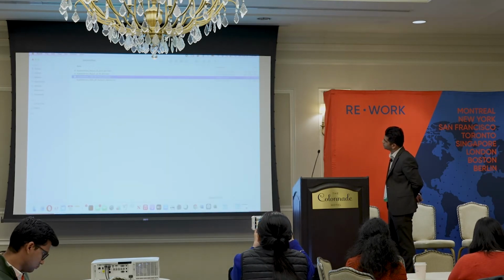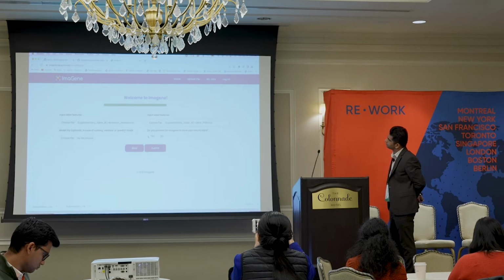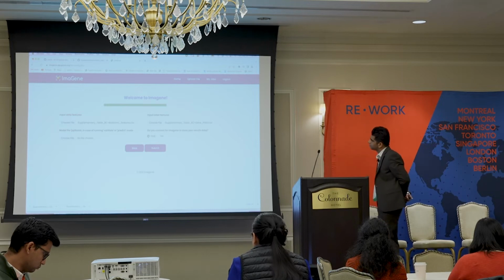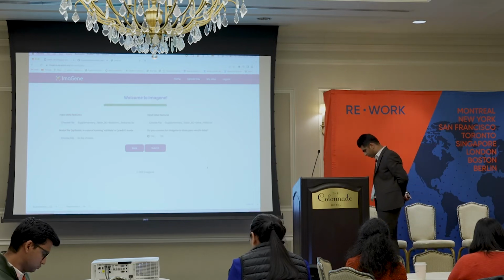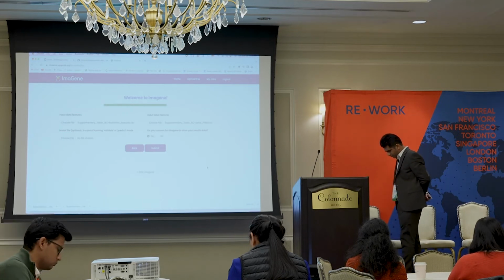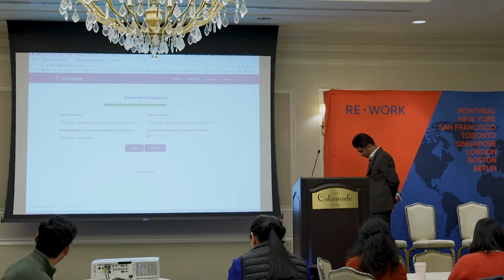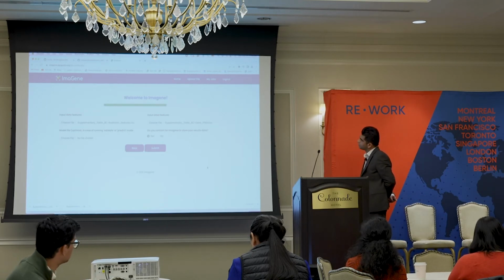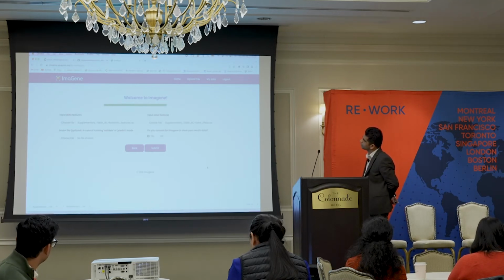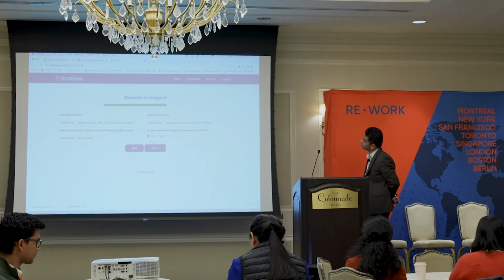Taking it further from there, once we have loaded the files, you have an option to choose whether you want to store the data for ImaGene, which is highly recommended, as this tool is meant to democratize radio-omic or imaging-omic correlations and machine learning models across the globe, such that a consensus could be arrived at on these models and radiogenomic reports thereof, to be shared across multiple labs worldwide. So I would highly request you to select yes. If you still think you don't want to share the data, feel free to select no.